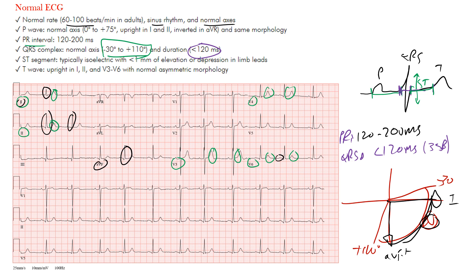Normal rate, sinus rhythm — this is a normal sinus rhythm. Normal axes: both the P wave axis and the QRS axis we saw are normal. Remember the normal P wave axis is within zero to positive 75 degrees, and that's what we see here. Same morphology in sinus rhythm. The PR interval was normal, the QRS axis was normal, the duration is normal, the ST segment is flat with no significant elevation or depression, and the T waves were upright with a normal asymmetric morphology.